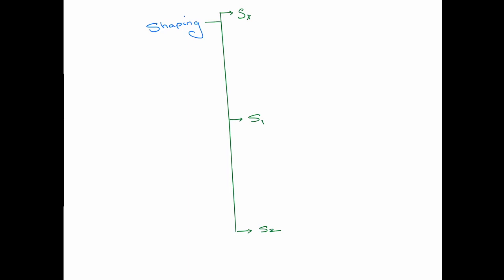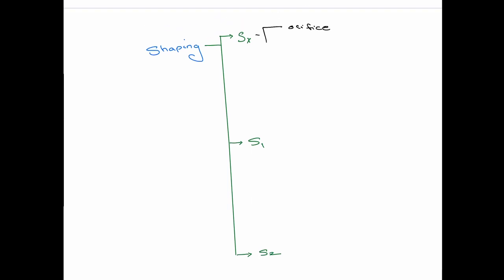Now when you come on to the shaping file SX, it was an orifice shaper. The orifice, the entry point, isn't it? The entry point shaper, that is the orifice shaper. I'll tell you the different uses. Orifice shaper, the SX, and the action of the orifice shaper is the same as Gates Glidden. Gates Glidden file.